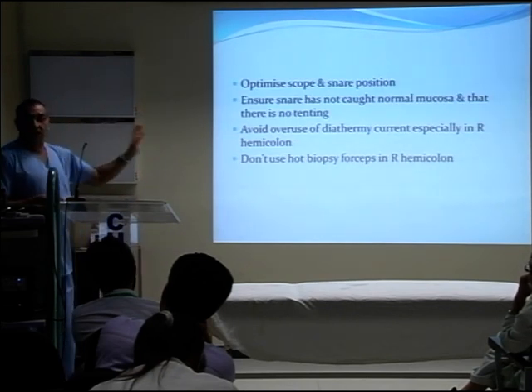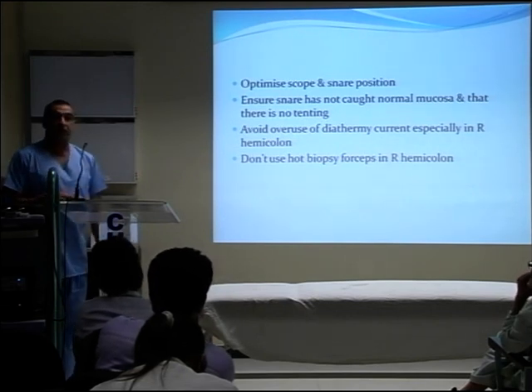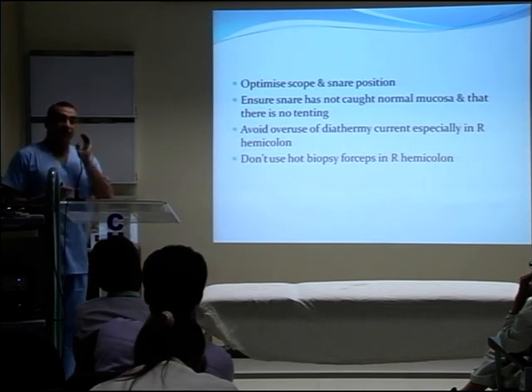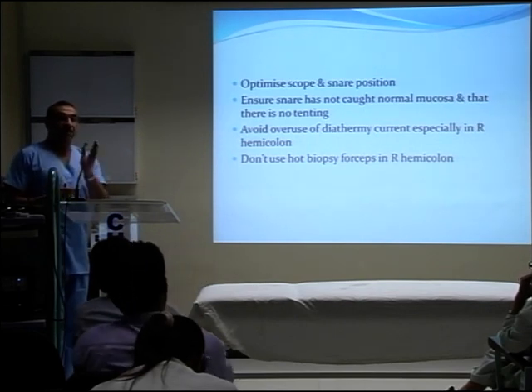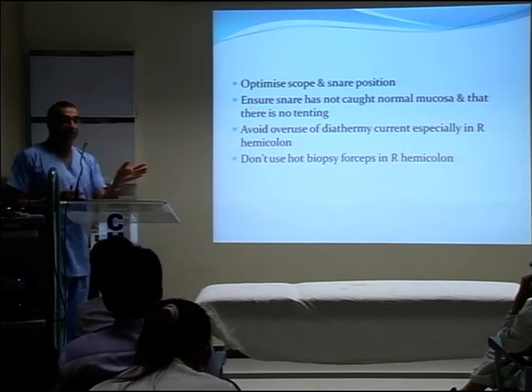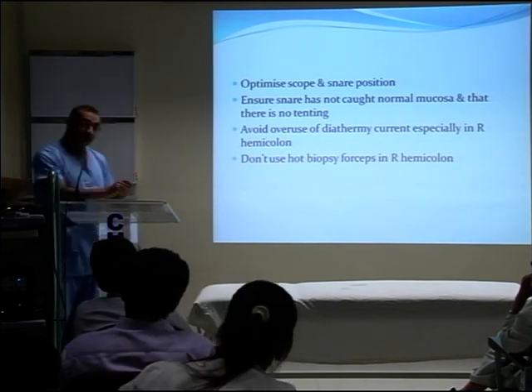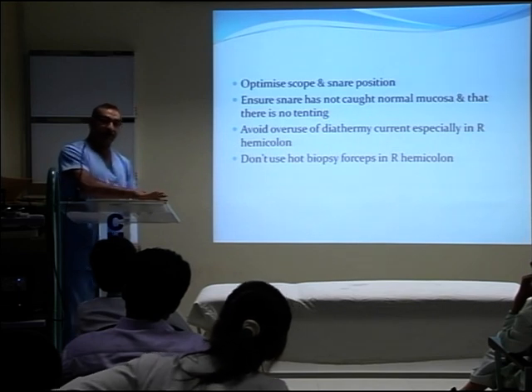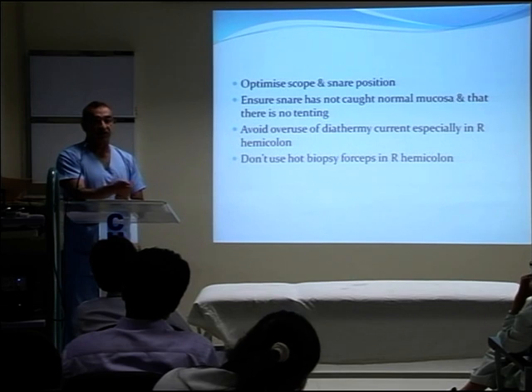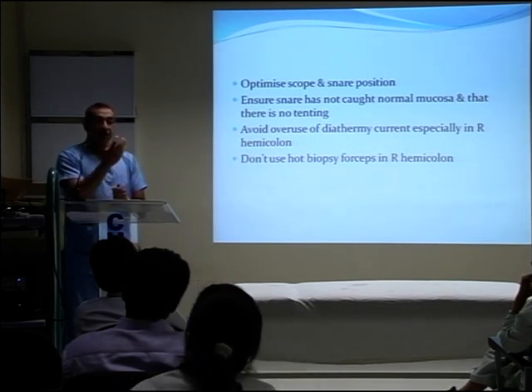Most important thing of all is never take a polyp out if you can't get to it. And that's what I've been trying to drum into your mind, the 5 o'clock position. If you cannot maintain the polyp in your 5 o'clock position, you will never be able to do a satisfactory resection. So always, if you get into a 5 o'clock position and it flips back, ask one of the nurses or your assistant to hold the scope for you in position. Because only once you've got an optimum position on it, you should go for it.